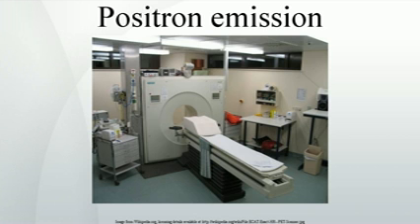Filtered back projection, FBP, has been frequently used to reconstruct images from the projections. This algorithm has the advantage of being simple while having a low requirement for computing resources. However, shot noise in the raw data is prominent in the reconstructed images, and areas of high tracer uptake tend to form streaks across the image. Also, FBP treats the data deterministically.